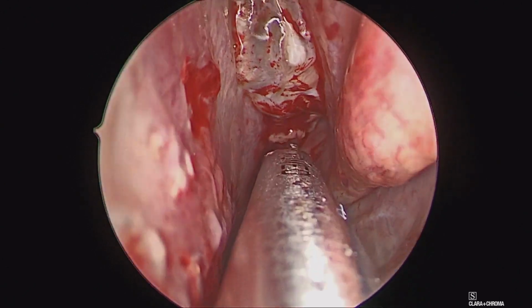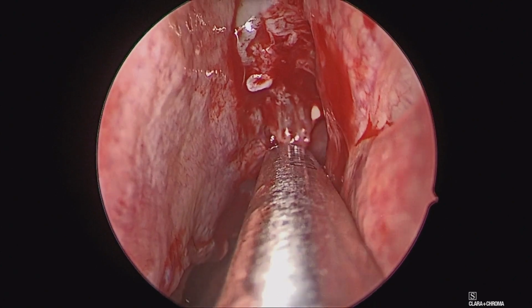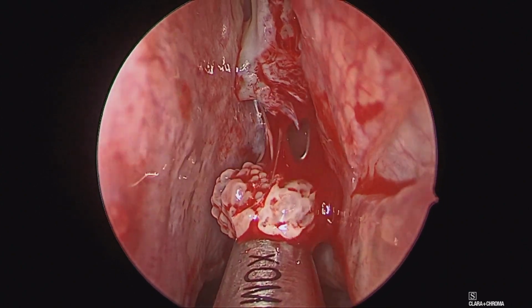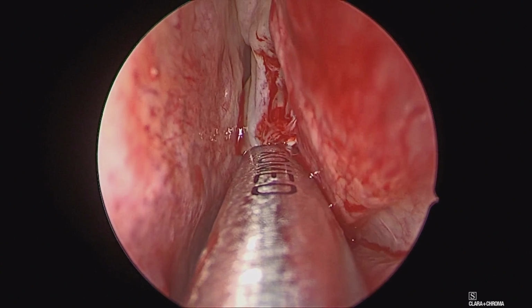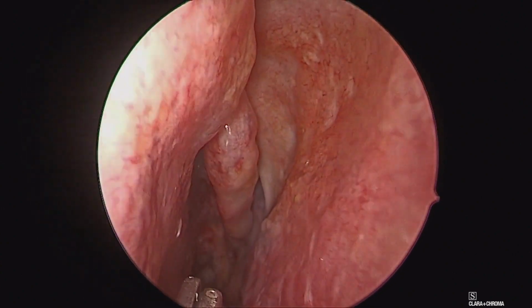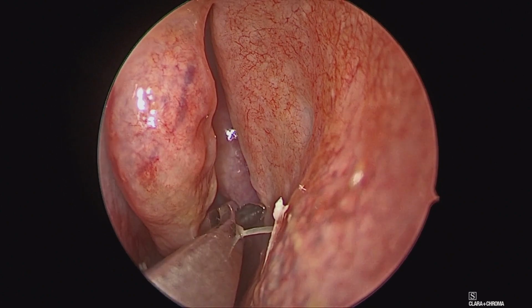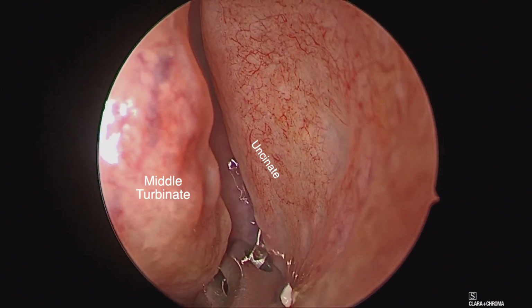What you can see here is the tumor, although it's present here in the olfactory cleft, has no attachments high along the cribriform or the olfactory fila, but instead you'll notice is actually protruding from the posterior ethmoid cavity at the junction between the basal lamella of the middle turbinate and the superior turbinate, and then coming into the nose medial to the middle turbinate. In light of this, we debulk the tumor in that particular area, and then we'll proceed with some routine sinus surgery on the left side in order to facilitate access to the posterior ethmoid cavity.